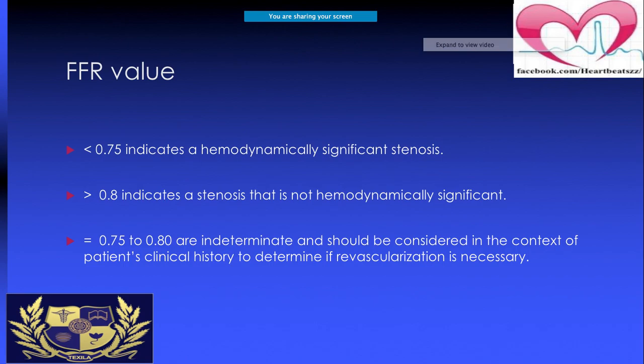So to summarize, if you directly get an FFR value which has been given after the procedure, if it is more than 0.8, it means there is a stenosis but it is not hemodynamically significant. Similarly, if it is less than 0.75, it means it's a hemodynamically significant stenosis.